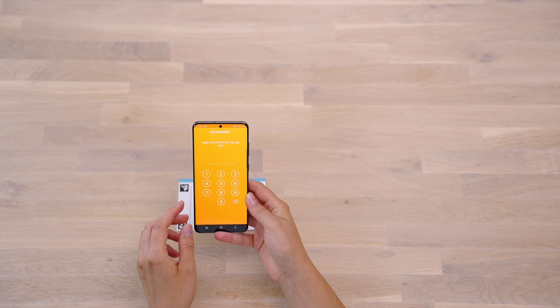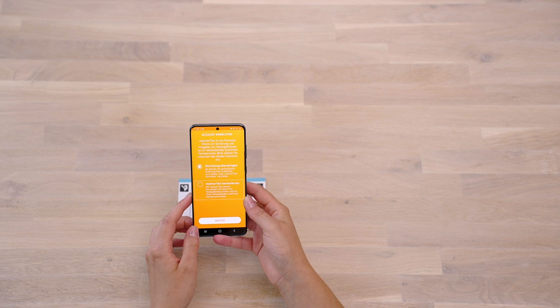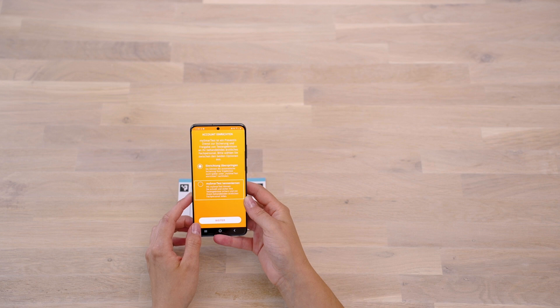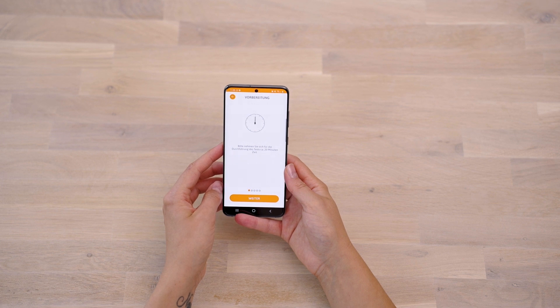Set a pin to protect your personal data and set up the app according to your preferences. My Smart Test is an optional portal where you can save your test results. In addition, with My Smart Test, you can share your test results with medical professionals. This way, your therapy can be monitored at any time and from anywhere, and a relapse can be detected early on and contained when therapy is adjusted. To start testing, press Prepare Test in the main menu of the Smart Test CalProtectin app.